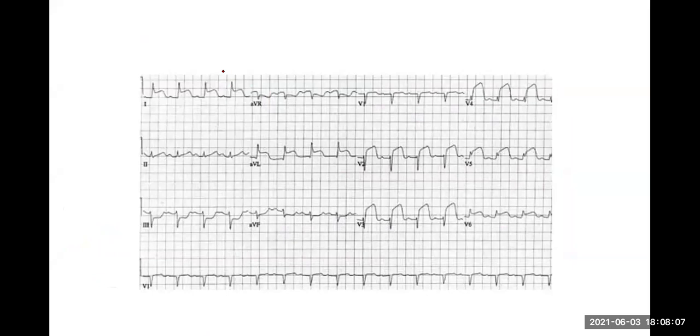So if you look carefully, there is ST elevation in lead 1, AVL, slightly in V2, V3, V1, all these leads. So think now, where is the STEMI? Where is the STEMI? So V1 to V6 all lines with extensive anterior, and remember I told you 1 and AVL are there.